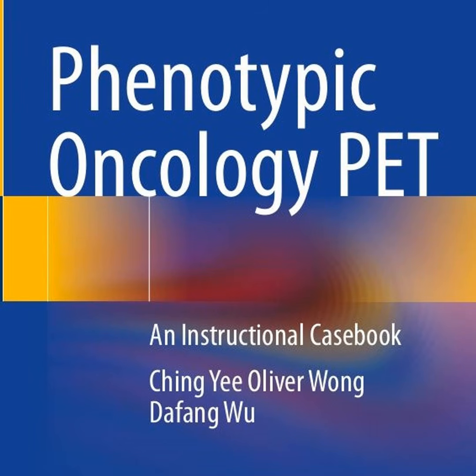You can physically see the mass occupying space in the lung on the CT side of the screen. So you already know it's there. Exactly. You don't need the PET tracer to light up uniformly just to prove the mass exists. Right. If you see a structural mass on the CT, but there's low glucose uptake on the PET, you now have this vital piece of phenotypic data. You know you're dealing with a tumor operating at a much lower metabolic gear.